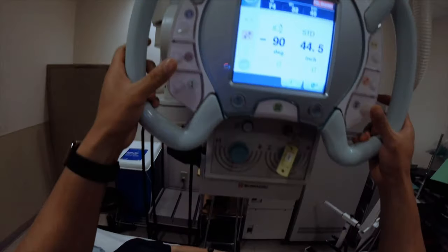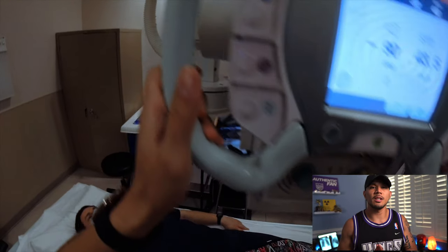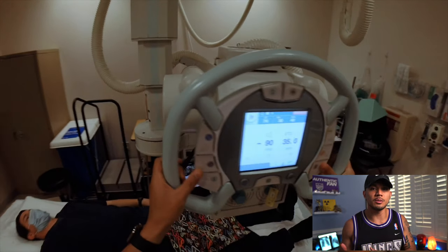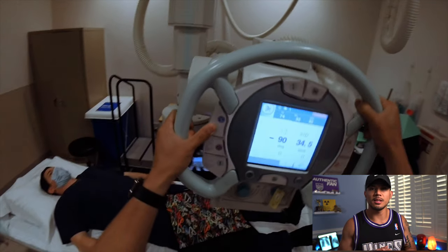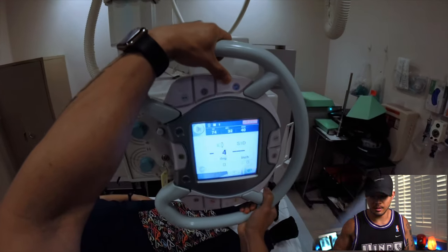So in a moment here, I'm gonna bring your good leg up and put your foot in. If this isn't your first time watching my positioning videos, I like to either demonstrate what I'm gonna have the patient do or just kind of talk them through what I'm about to do. That way they're not surprised at what I'm doing, they're in the loop, we're on the same page, and they're just informed. It's a great patient experience in my opinion. Your left hip.